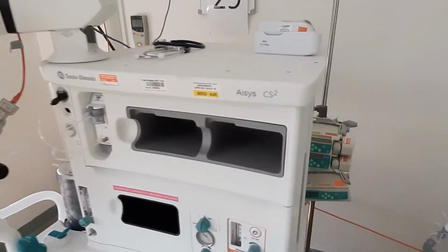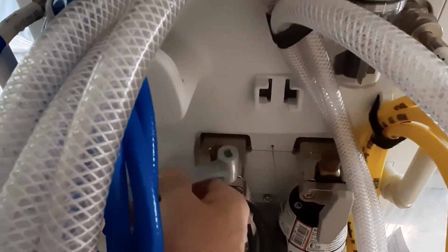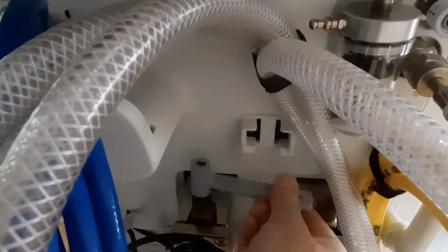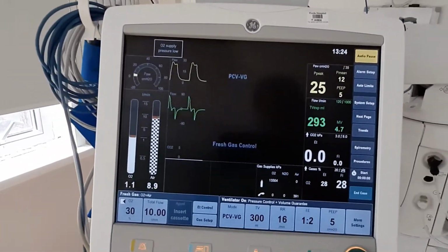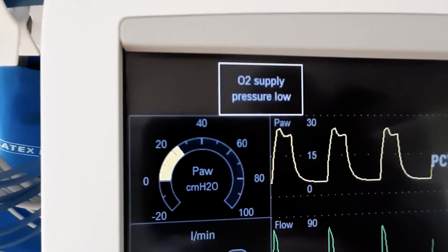The ventilator cannot operate without compressed gases, and we need to open the spare oxygen cylinder on the back of the anaesthetic machine immediately. This stops the alarm sound, but a message indicating low supply pressures of oxygen remains on the screen.